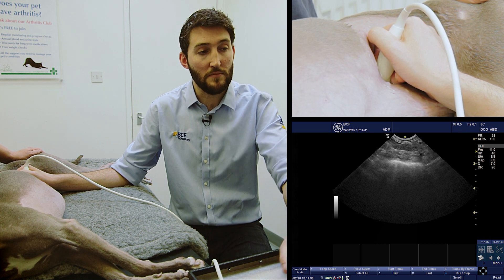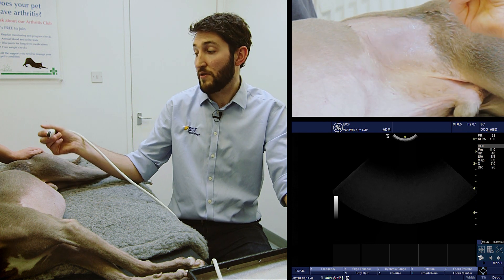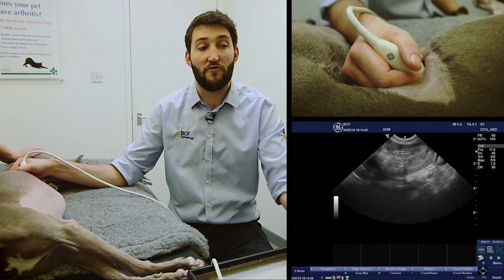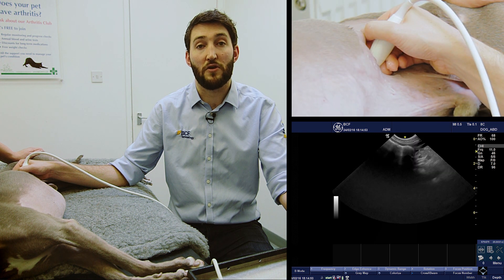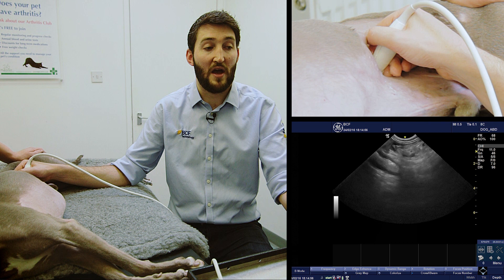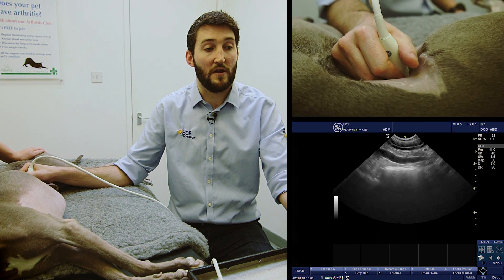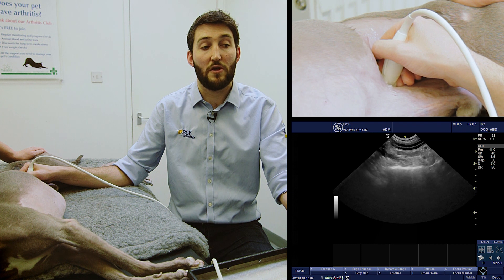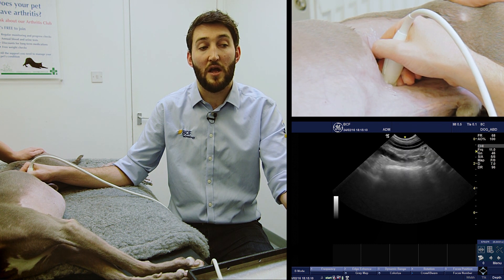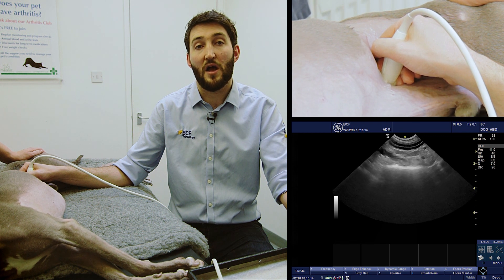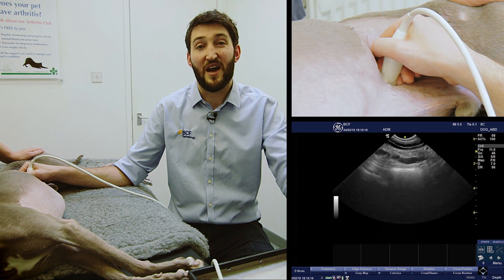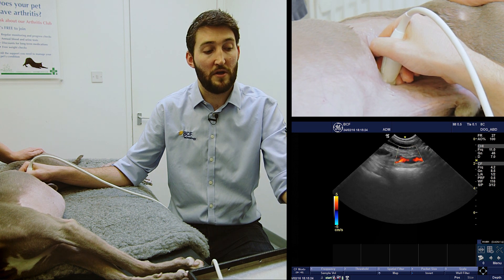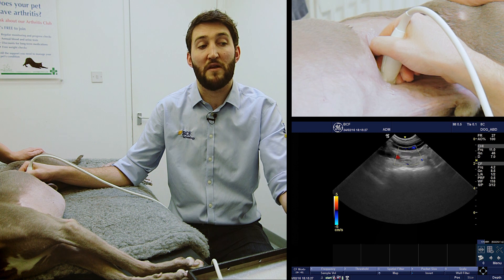To run through the technique one more time: starting in longitudinal plane, find the left kidney, then slide ventrally off the left kidney until you start picking up those mesenteric vessels. Then fan around following those vessels to find the lymph nodes. Here's another example — we've picked up a vessel, and lying along the top of it is a slightly hypoechoic fusiform-shaped structure, which is the jejunal lymph node. Applying color Doppler confirms flow in the lower structure but no flow in the upper one, confirming it as the lymph node.